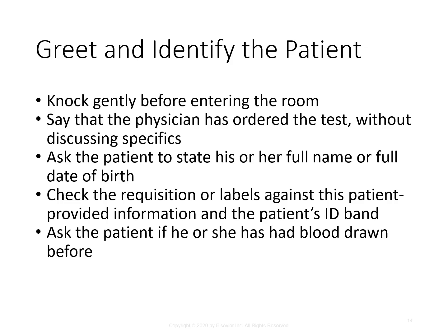To greet and identify the patient, you're going to knock gently before entering the room. You're going to say that the physician has ordered the test without discussing any specifics. You're going to ask the patient to state his or her full name and full date of birth. You're going to check the requisition or labels against this patient-provided information and make sure that it matches. And you're going to double check the ID band as well. You're also going to want to ask the patient if he or she has had blood drawn before, because they may not be aware of what's going to happen.